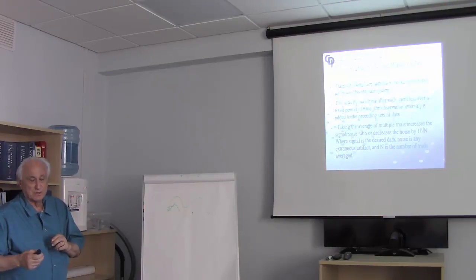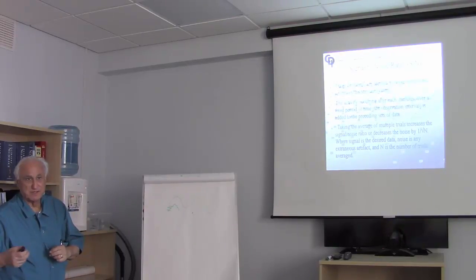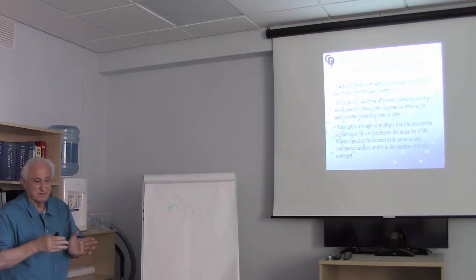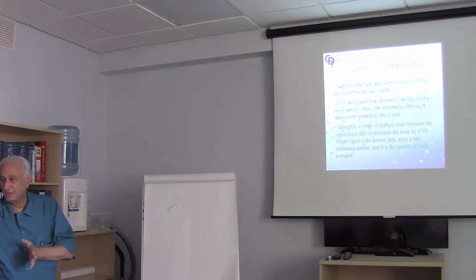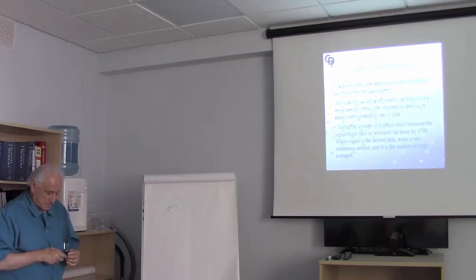And if you test the same person year after year, exactly the same way, you're going to see essentially the same response recorded from the same electrode locations, except for the effects of aging. And I've done that on myself, so I've followed myself for many years, and my stereotypic response didn't change except for the effects you would expect to see with aging, and we'll talk about what those effects are later on.